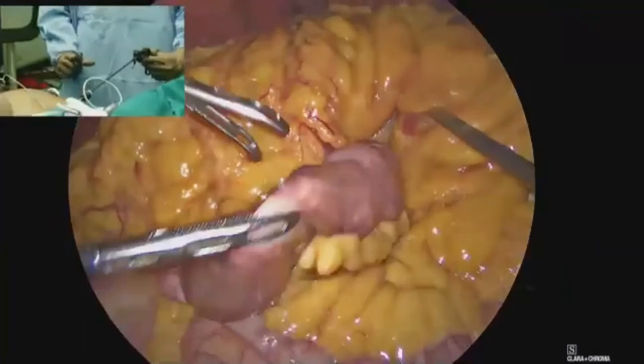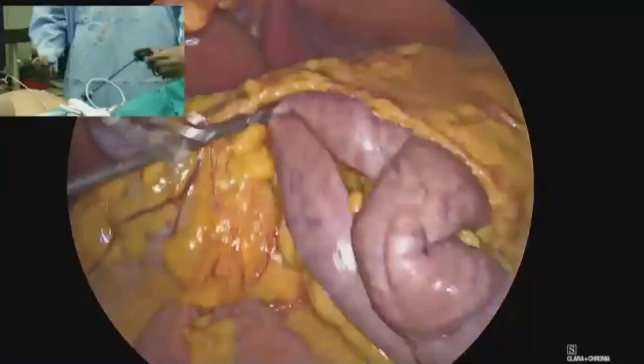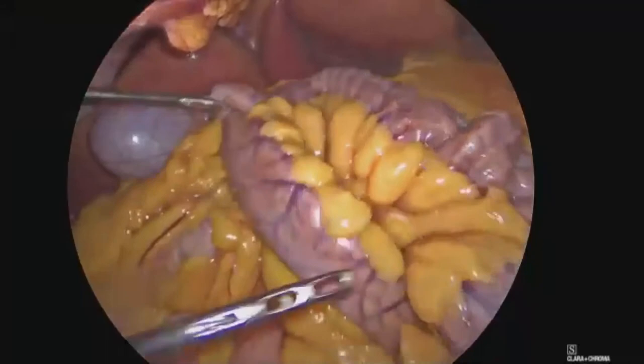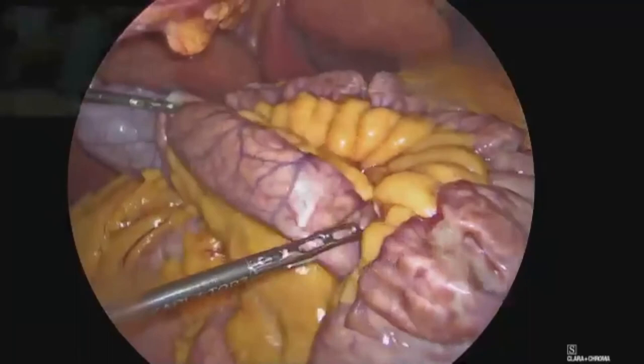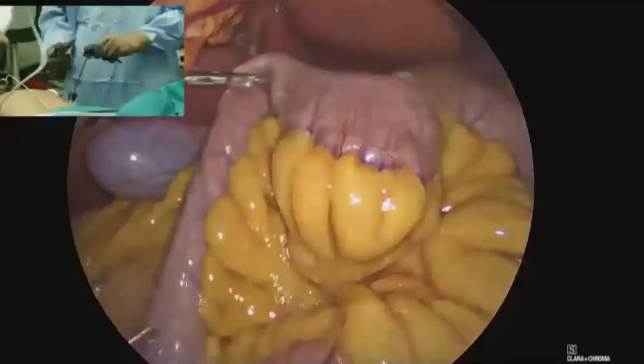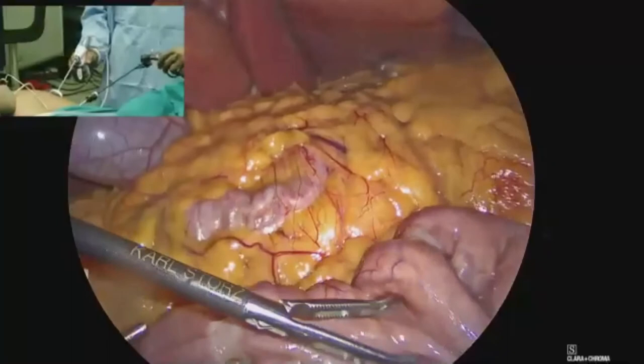So that's 10, 20, 30, 40, 50, 60, 70, 80, 90, 100, 110, 120, 130, 140, 150, 160, 170, and 180. So that's the length which we usually use to bypass at our center. 180 has been the standard for one anastomosis, and we will make an enterotomy here.